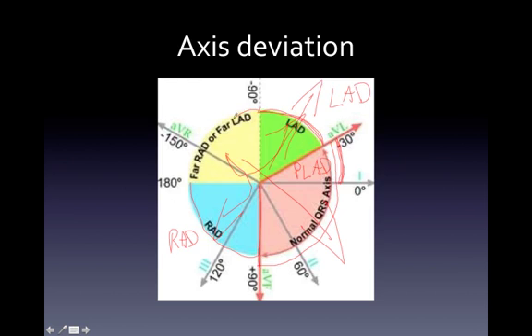This section here should be your starting location for your electricity, not the ending location. So if electricity is actually headed into this zone, it probably started in the ventricles somewhere. So really look at your clinical indications for possible VTAC. This is called ERAD, or extreme right axis deviation.